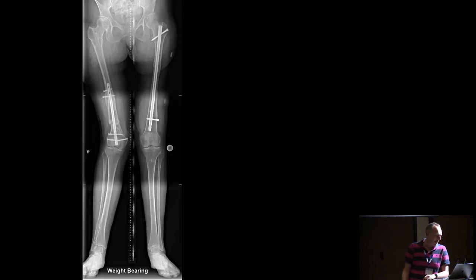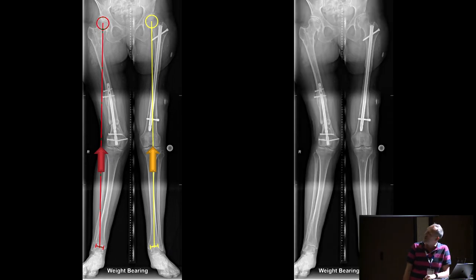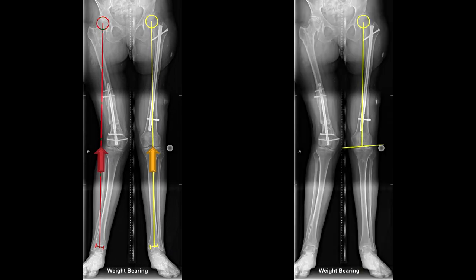So I'll go and talk about this. Here is something that hopefully you'll be familiar with. We define the deformity for the patient. Hopefully they're projecting. And then we do our standard deformity planning, as you've learned. This reveals a deformity in her distal femur.